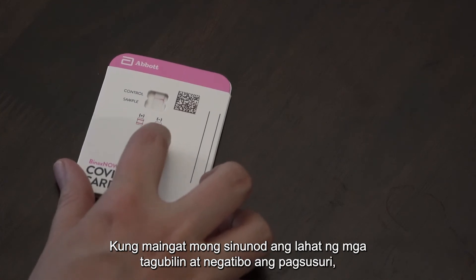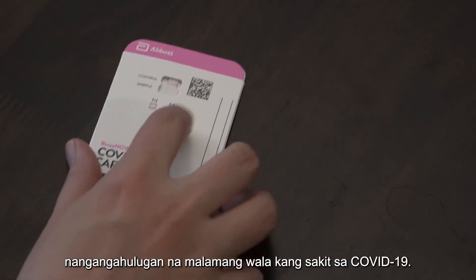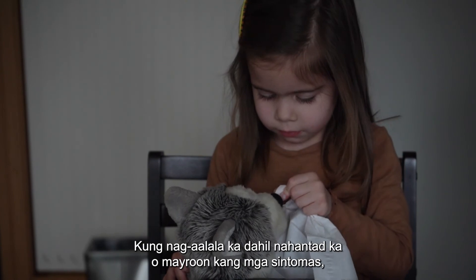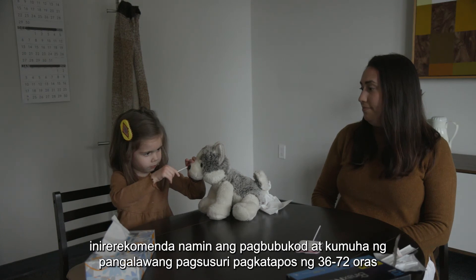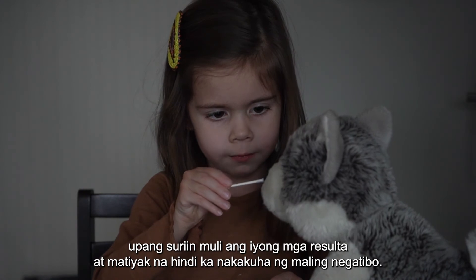If you followed all the instructions carefully and test negative, that means you're probably not sick with COVID-19. However, it is possible for a test to sometimes give a false negative. If you're concerned because you were exposed or have symptoms, we recommend isolating and taking a second test after 36 to 72 hours to double-check your results and make sure you didn't get a false negative.